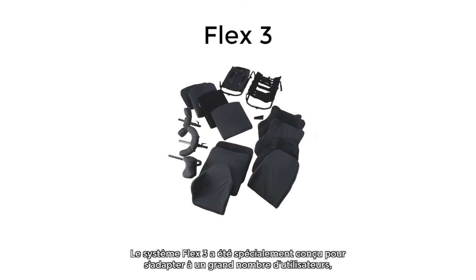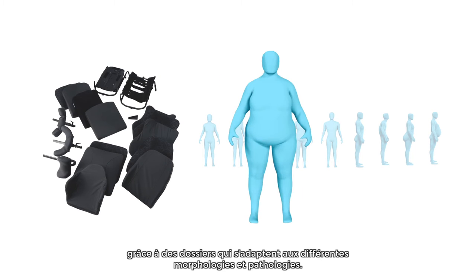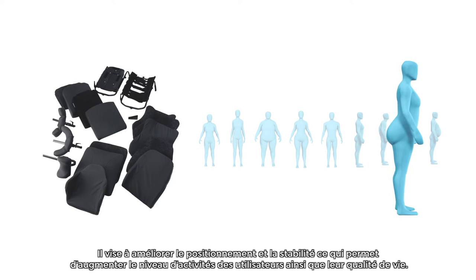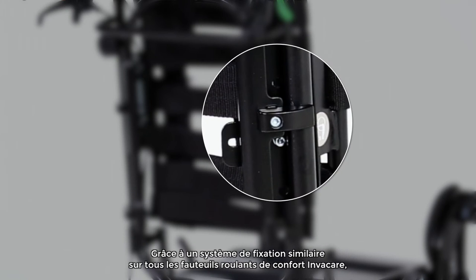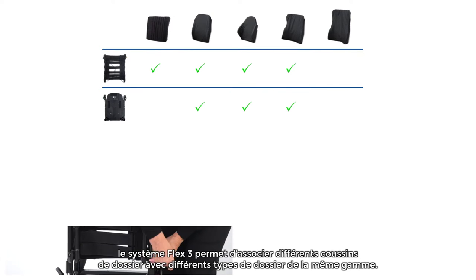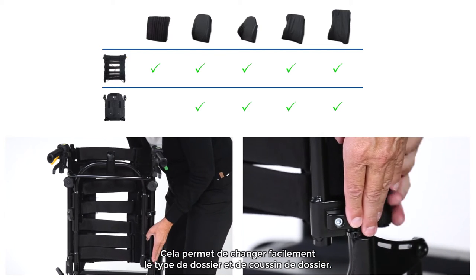The Flex 3 system has been specially designed to fit a variety of users, allowing a seat to be tailored to different body shapes and disabilities. It aims to improve posture and stability, which in turn increases activity levels and quality of life. With the same attachment on all Invacare passive wheelchairs, the Flex 3 system provides the flexibility to combine backrest cushions with backrest types across its range, allowing for backward compatibility and enhancing refurbishment.